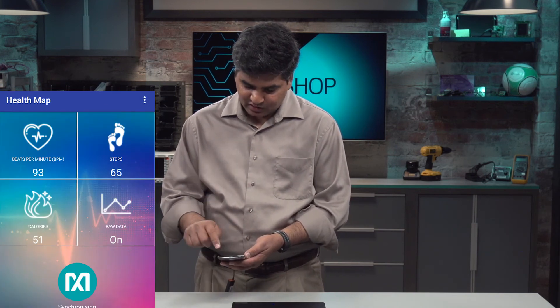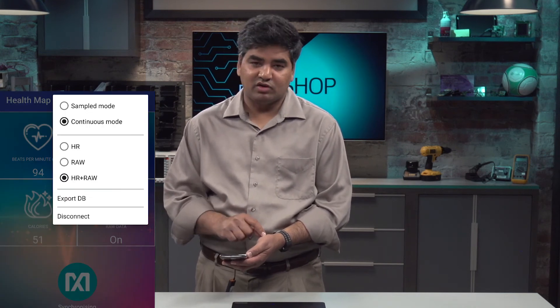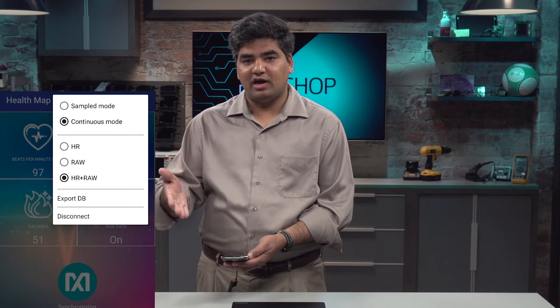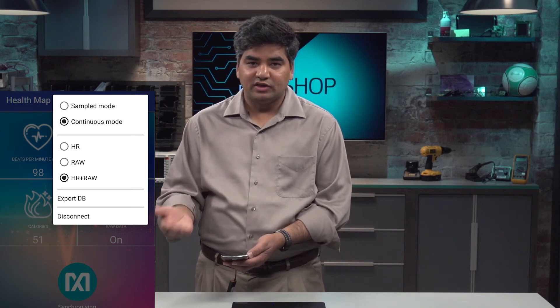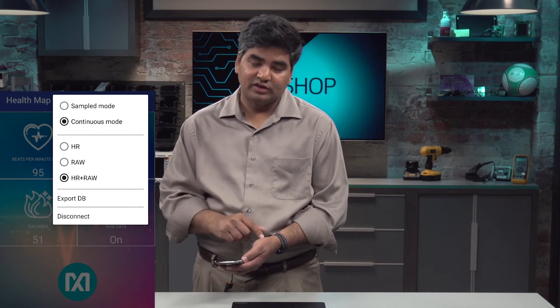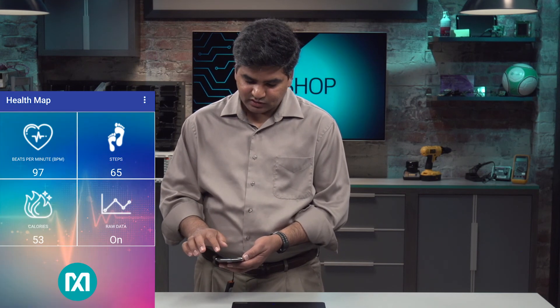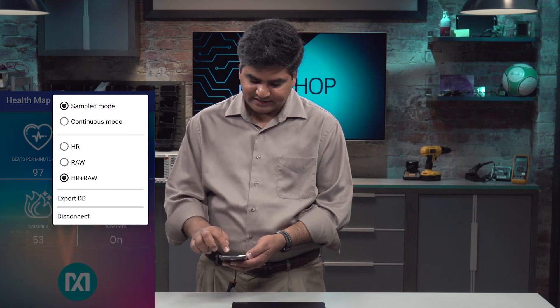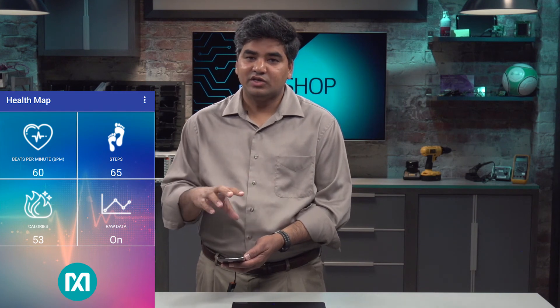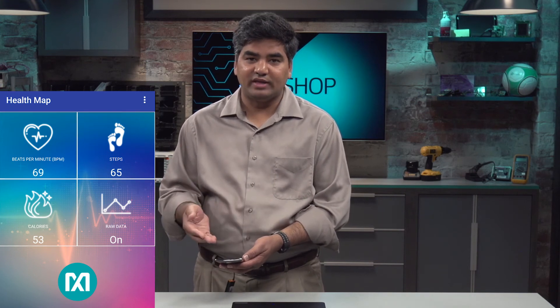Looking at the menu options in the top right corner, you have a couple of different options to choose from. The first is sampled or continuous mode. Sample mode allows you to sample the heart rate every few seconds or minutes to save battery power. On the other hand, if continuous monitoring is critical, you can configure it to run in continuous mode. When you switch modes, it sends a buzzer signal to the Healthband to switch the configuration in real time — configuration settings are sent from the app to the Healthband over the air.